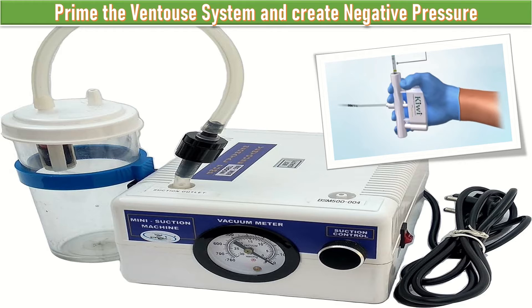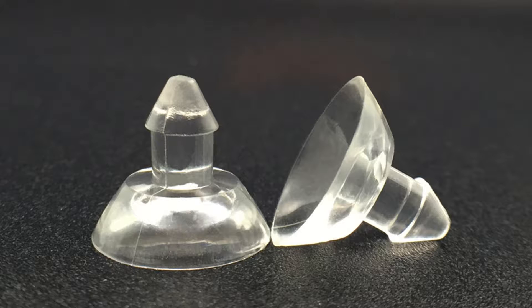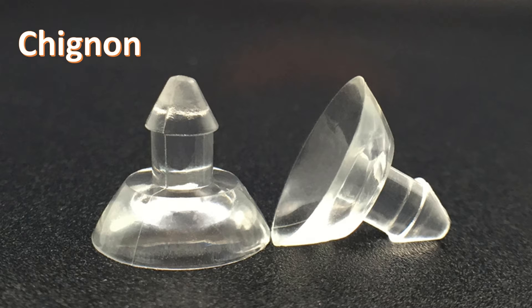Once the pressure has reached 0.2 kg per centimeter square, it is rechecked for the inclusion of soft tissue in the cup, then gradually taken to the maximum of 0.8 kg per centimeter square to create a chignon of 10 to 20 millimeters. In between contractions, I will delay traction for two minutes to allow the chignon to form.